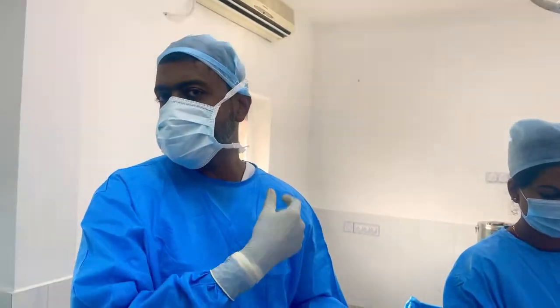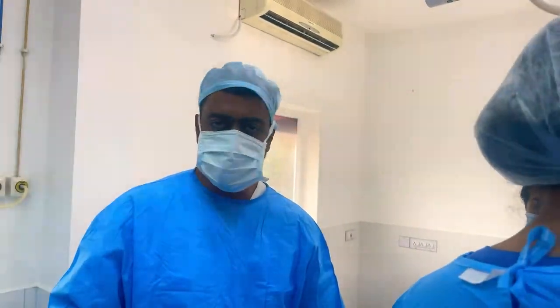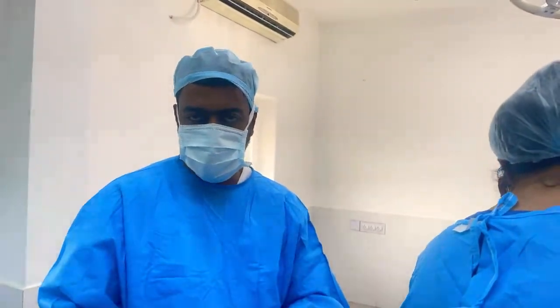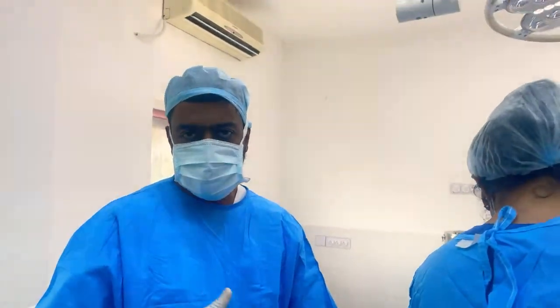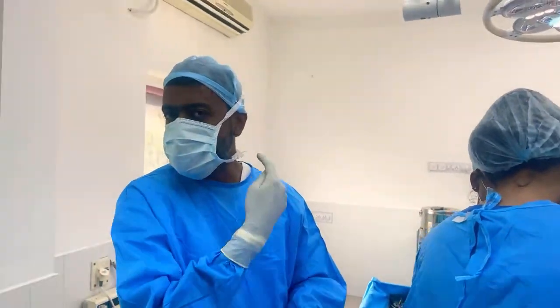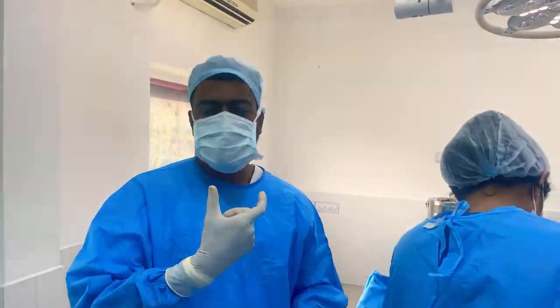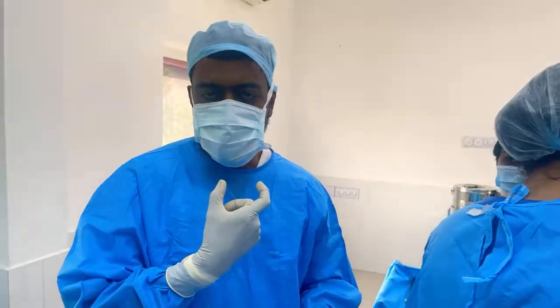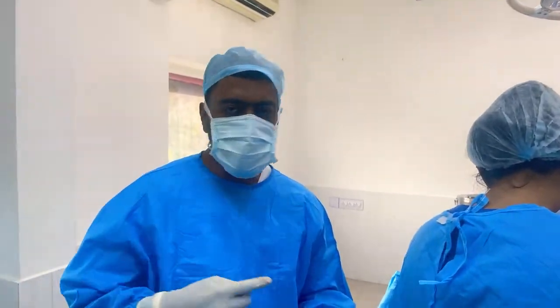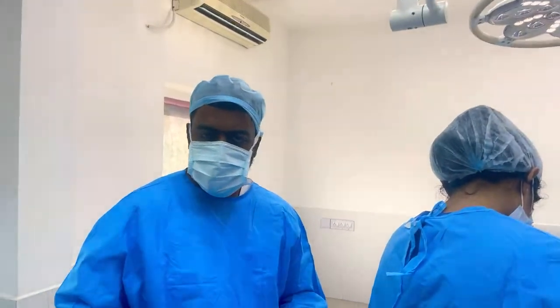Torticollis is a condition of the sternocleidomastoid wherein the neck gets tilted, the face gets turned towards one side, so it causes imbalance in the growth of the mandible. And so we've now corrected that by working on the entire aspect of the lower jaw, from the ramus, which is the vertical part of the lower jaw, the entire horizontal part, the front part of the jaw, which we call the chin, this part again the body, all the way up to the angle. This ramus we haven't touched for this patient. So that's in short. Now we're just going to suture up.